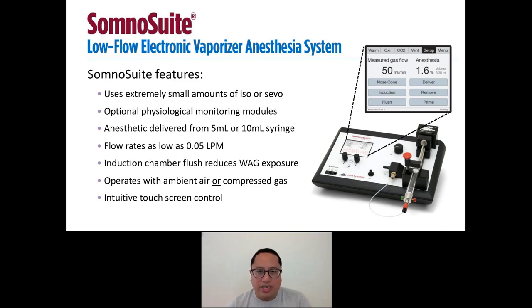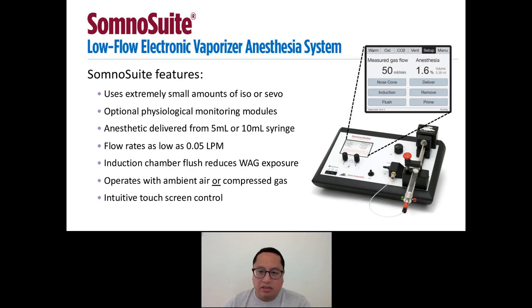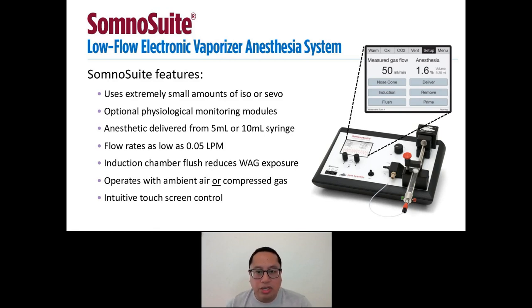The SomnoSuite has an intuitive touch screen control. Both the flow rate and anesthesia percentage are displayed in large numbers. Along the top are tabs for the additional modules that can be added to your SomnoSuite. The Remove button is used when you need to fill your syringe. The glass syringe itself is filled with the anesthetic such as isoflurane. The Prime button is used for preparing the pusher block to deliver the anesthesia. When you are ready to anesthetize your animal, you will touch the Deliver button to deliver the anesthesia plus either the nose cone or induction buttons to turn on the flow. The Flush button will add a layer of air with no anesthesia to reduce waste gas exposure to the user.